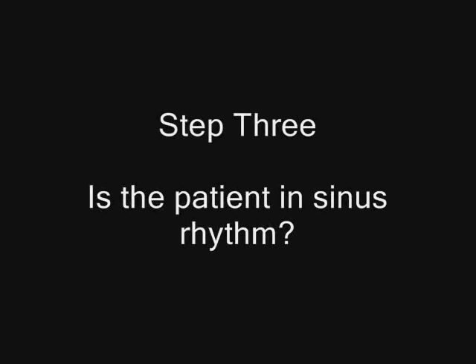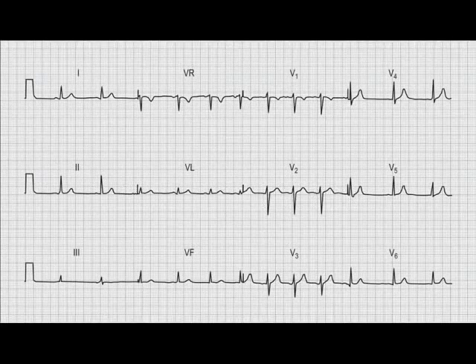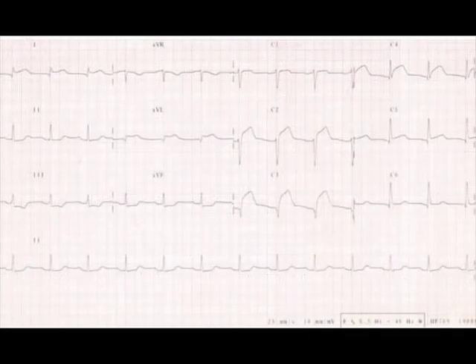Step 3: is the patient in sinus rhythm? If they're in sinus rhythm in one lead, they'll be in sinus rhythm in all leads. You can't have a mixture of different arrhythmias in different leads, because the ECG is recorded at the same time point — the electrical activity is just looked at from 12 different angles. Take a look at the rhythm strip printed along the bottom of the recording, because this will give you the most complexes. The leads above only give you a few complexes to work with. If there is no rhythm strip, look at lead 2. The rhythm strip is normally lead 2, because it's a very upright lead.